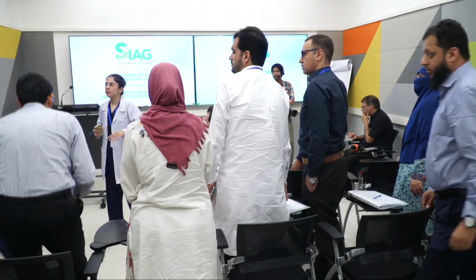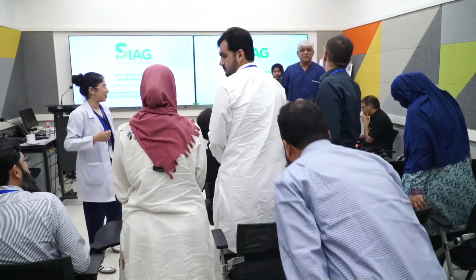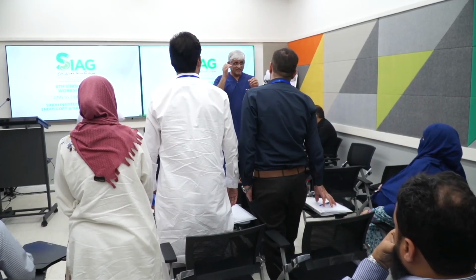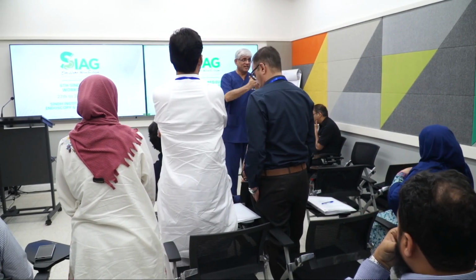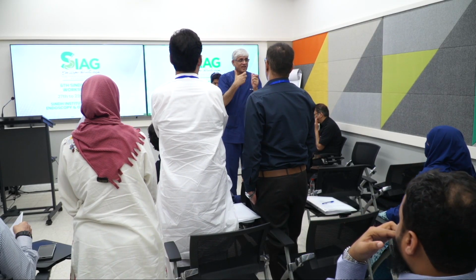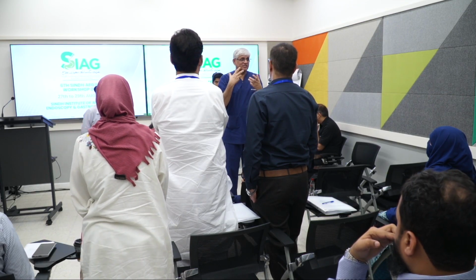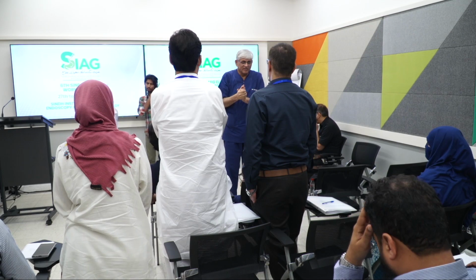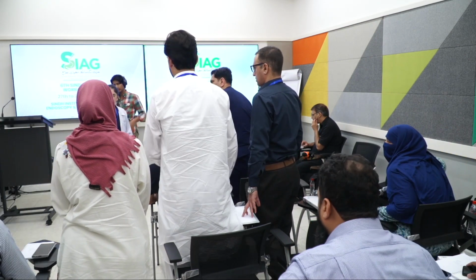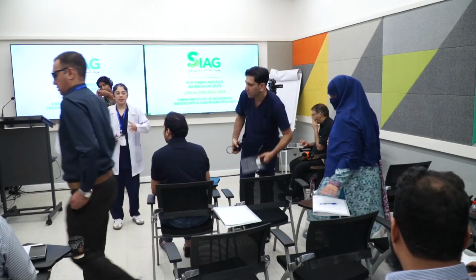Obviously this is something that you've only done a few times. The concept here is, the sheath comes out or doesn't, the needle goes in, and how you move your needle up and down, all those can be done. You can inject, and the fluid will come out. So this is like a cyst aspiration. That's what we're doing. We're working on other models, but hopefully in the next year. Hands-on relevance comes with time, and observers can watch it.